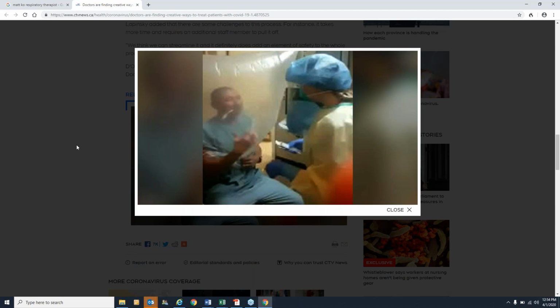We did try to save the OG, but if it's going to be in the way, it's going to come up anyway with the tube. And then we dropped the cuff underneath. We made sure that suction was ready and on. Then we discontinued mechanical ventilation, and once the cuff was down, we pulled the ETT from outside by grabbing it through the bag.